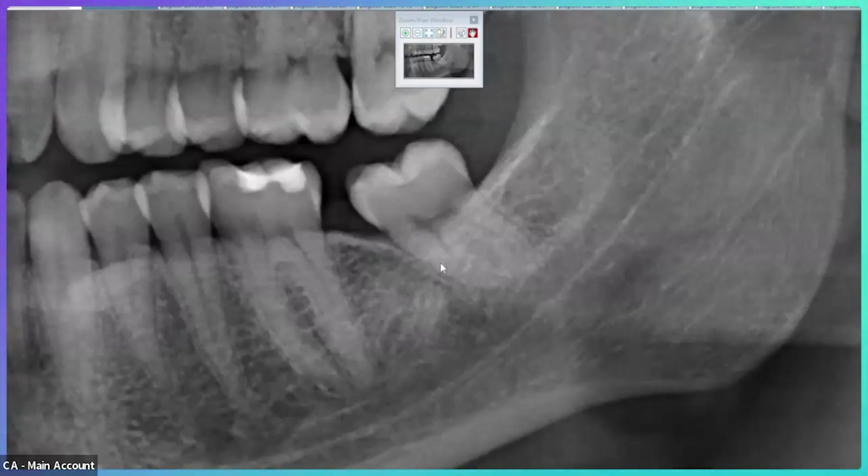So there's two key things that we're going to hit with Matt right away. Number one is the fact that if we are moving this tooth forward into that position, we need you to be extraordinarily compliant. Because if you're not compliant and you don't wear these trays perfectly, we're not going to be successful with the Invisalign trays. It's just the reality. Number two is we're going to give ourselves an out right from the very beginning. We're going to talk to Matt about the fact that we might use other things to help out if the aligners aren't proving to be as successful as we hope.